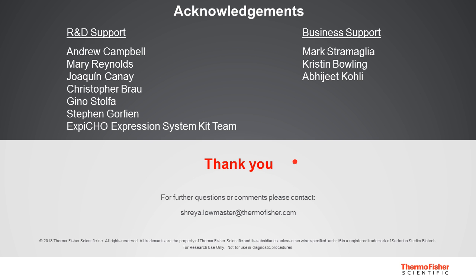And what vector do you recommend using with the platform? We would generally recommend a vector that does not require cell line engineering, so an antibiotic-based vector, such as pcDNA 3.3 or 3.4.